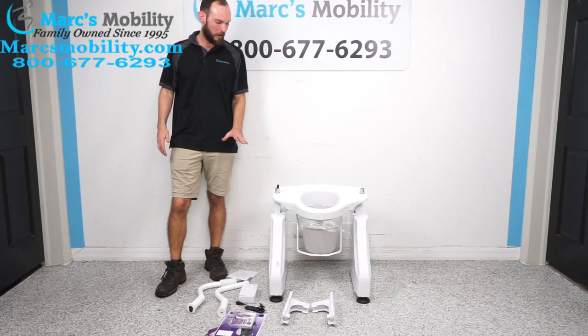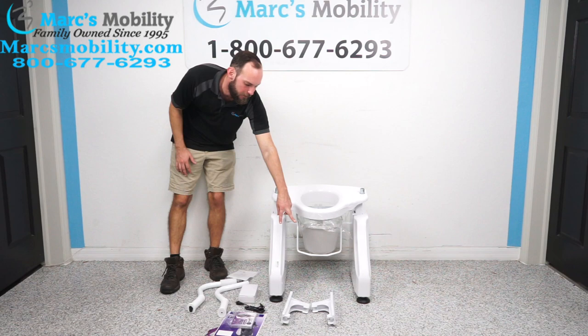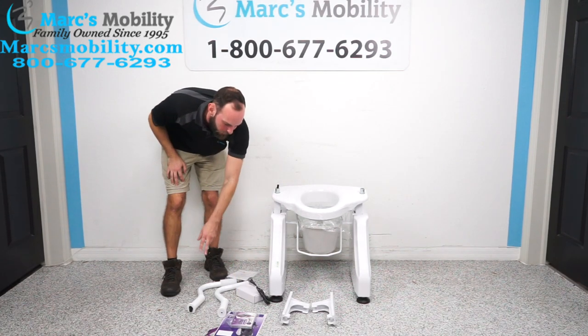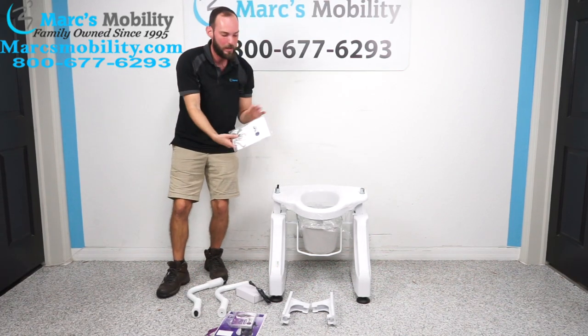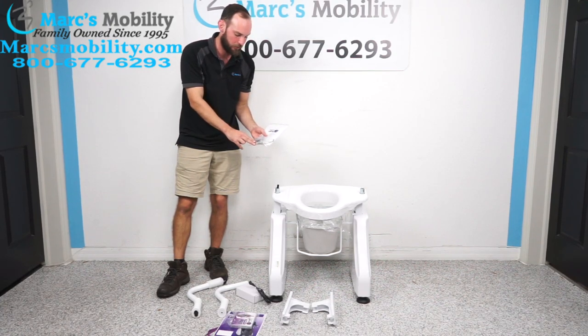Now I have all the packing material away. What we have is our base, two armrests, some product inserts, our charger and an extra charging cable. One armrest actually has your power switch. Then we have this bag here with our user's manual, mounting brackets, and Allen screws.